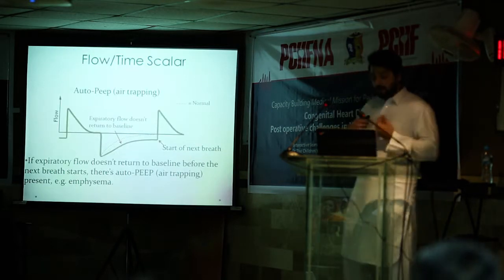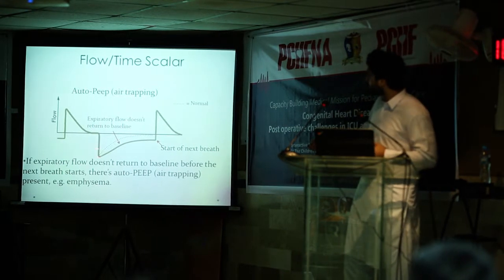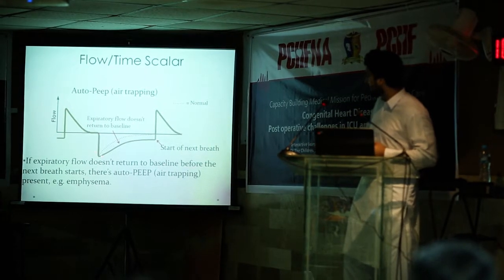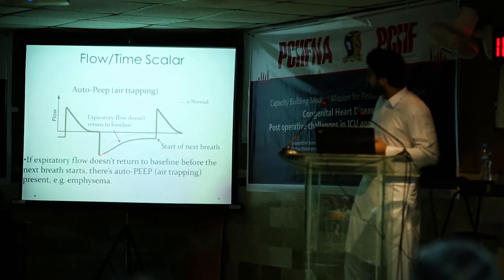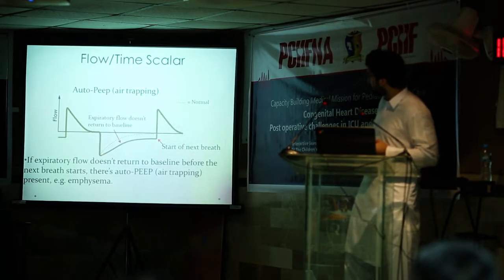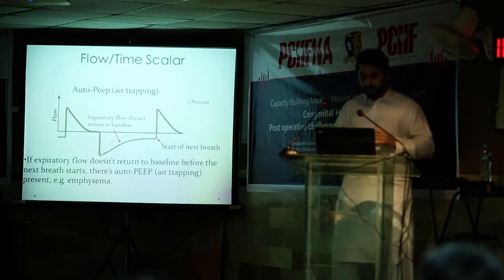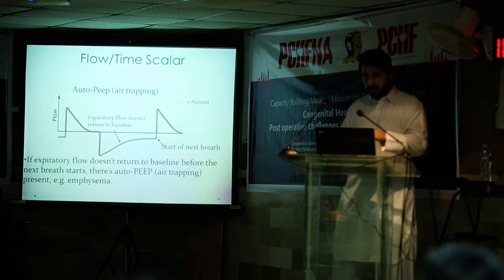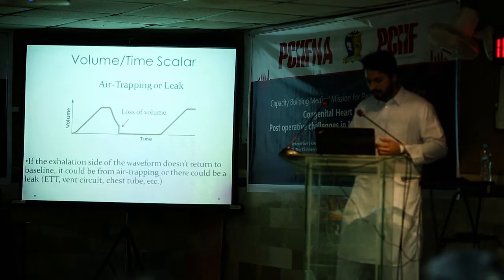From the flow, which is my favorite one, I can easily recognize it. Usually in the flow, this is inspiration and expiration. It should come back to the baseline. If it doesn't come back to the baseline and inspiration starts again, the trigger is here again and inspiration again, that means there is air trapping. That's my best way to know air trapping.